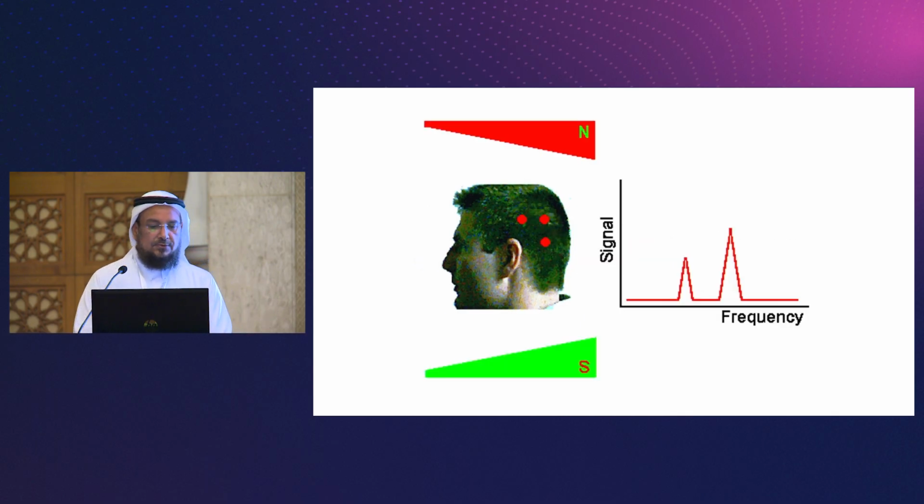So if we introduce the gradient, we agreed at the beginning that the proton will increase the frequency or the speed with the magnetic field. As we increase the magnetic field, the proton will precess faster. So this proton is exposed to less magnetic field because the magnetic field there is less, so the frequency will be again less. As we increase the magnetic field, these 2 protons will be exposed to more magnetic field, meaning they will spin a little bit faster, or they have a higher frequency. This can be translated there. That single proton has a single peak, so it's, for example, 1 amplitude and less frequency. These 2 protons have more amplitude, double the amplitude, and more frequency.